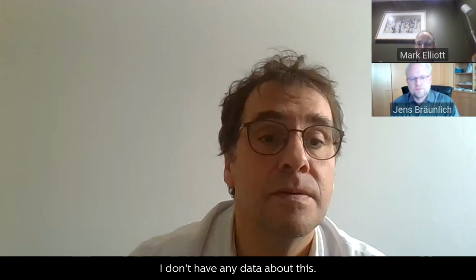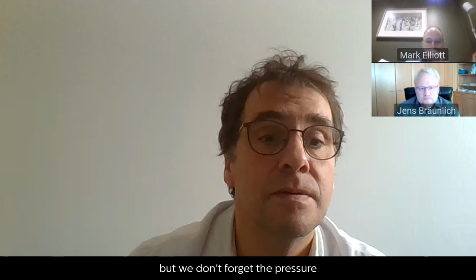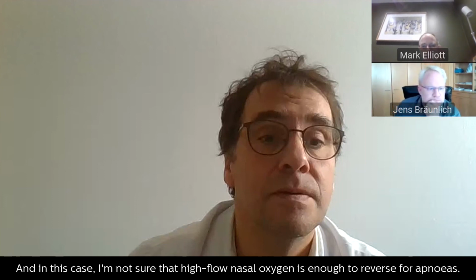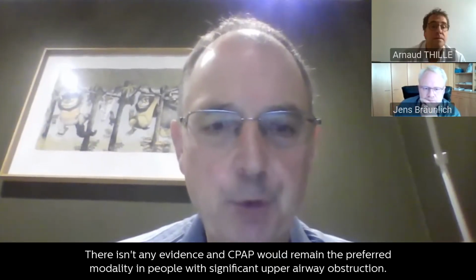I don't have any data about this. As Jens said, it could be interesting in patients with chronic obstructive pulmonary disease, but let's not forget that CPAP, at least 5 centimeters of water, using non-invasive ventilation is the best treatment for patients with really obstructive apneas. In this case, I'm not sure that high flow nasal oxygen is enough to reverse apneas. These post-operative patients have a high risk of apneas. They should receive non-invasive ventilation, and I'm not sure high flow is enough. There isn't any evidence, and CPAP would remain the preferred modality in people with significant upper airway obstruction.